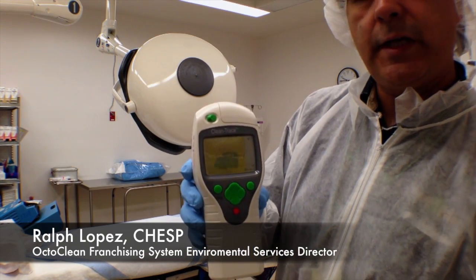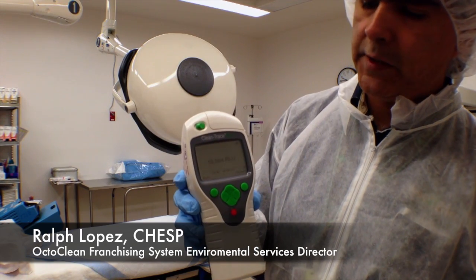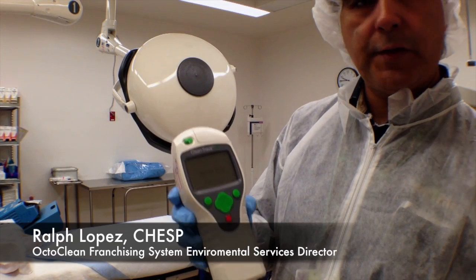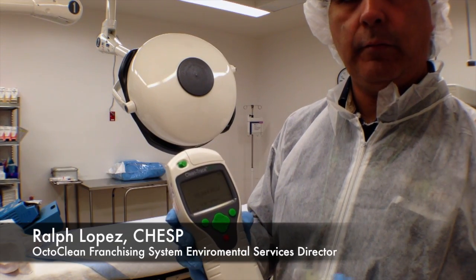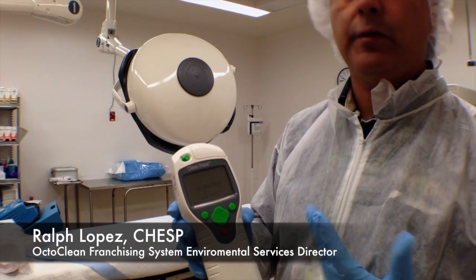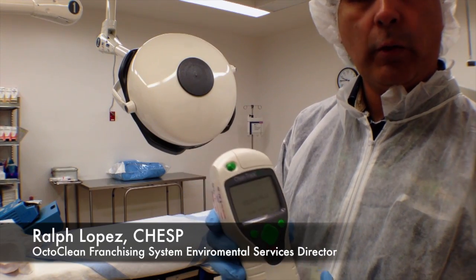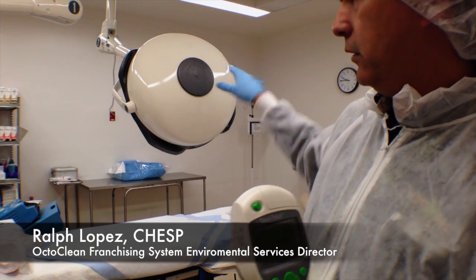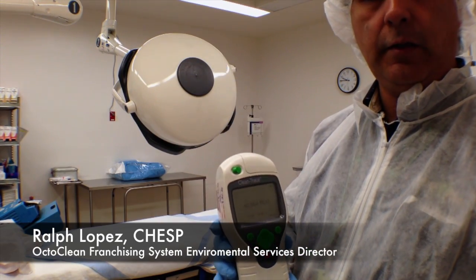We have a little over 10,000 relative light units, meaning there is considerable bio load on the surface. Bio load could be anything from dust, debris, or dander that's been circulated around the room for possibly several hours and has settled on surfaces in the actual room here.